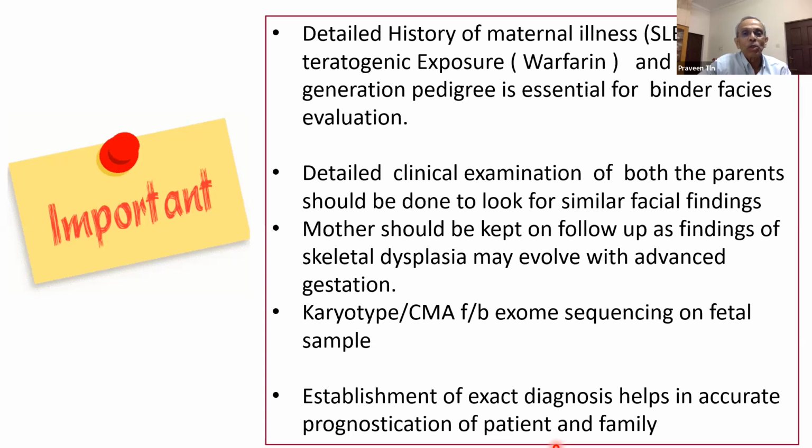Because I can use them. Yeah, the girl-boy issue is sorted out by the PNDT disclaimer, so that we absolve ourselves of that altogether. The other thing is, we use pictures like just what Dr. Shagun showed here. We do a 3D reconstruction of the face and show them what this fetus is looking like. For the future, we use the 3D. They get horrified, I'm telling you genuinely. No, sir, it actually sometimes helps, because they just see that it is like that. You turn it sideways, show them the contour is like this.